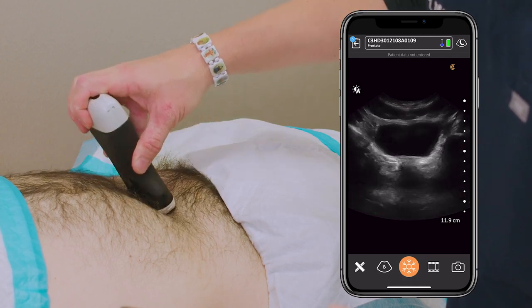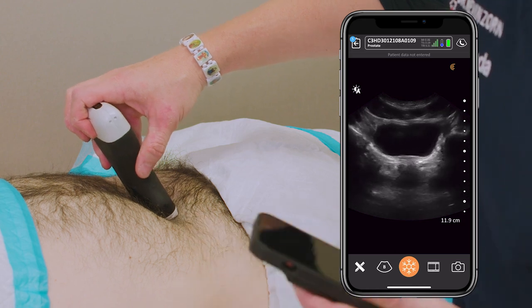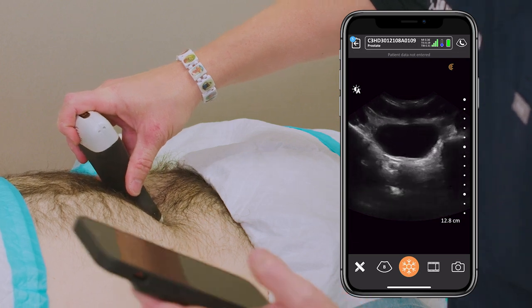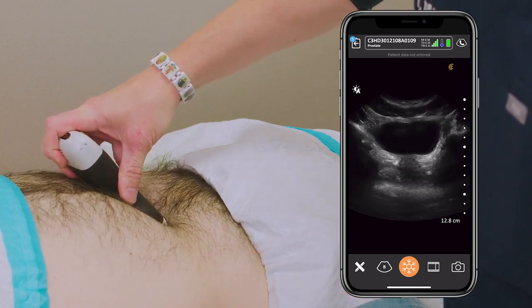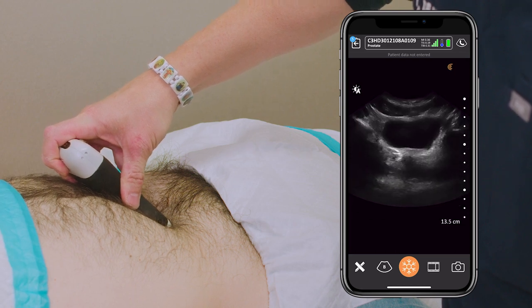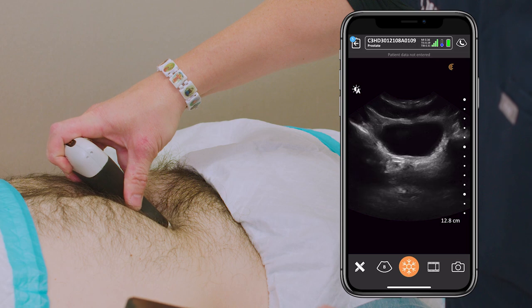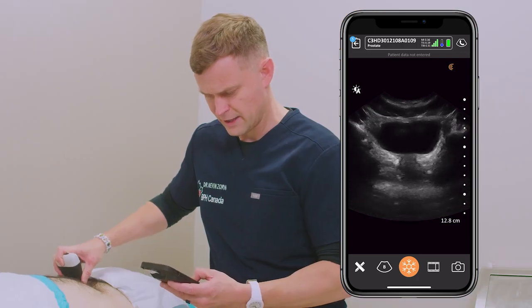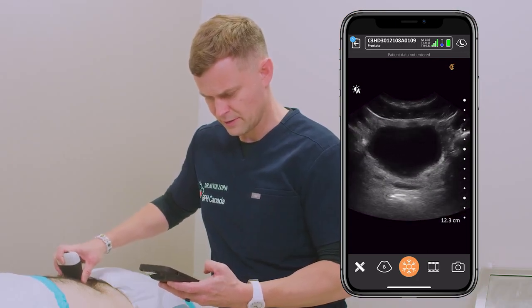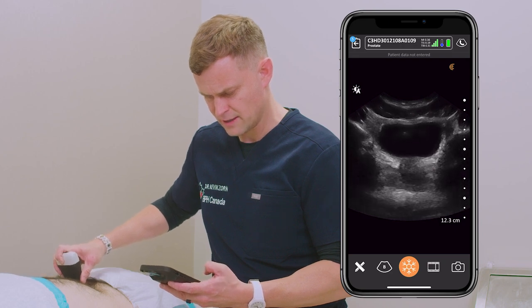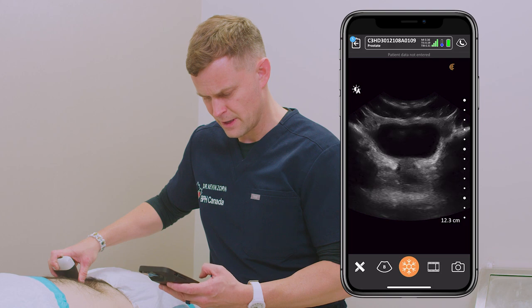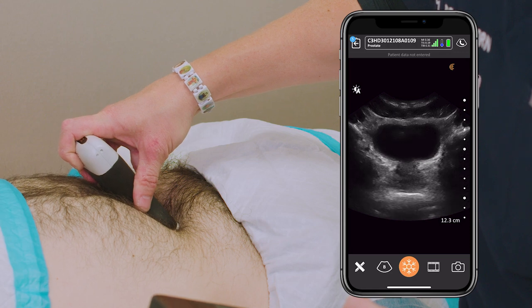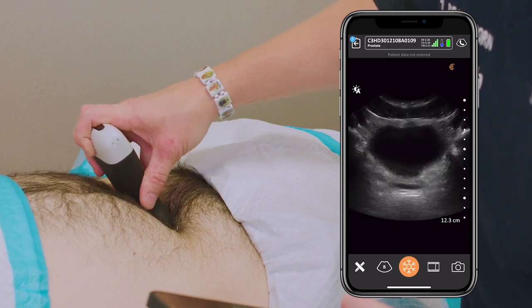This is where I'll depress down on the belly. For patients who are more obese we'll ask them to lift up their pannus so that it flattens the area. I usually want to push downward and cephalad toward the head and then get underneath the pubic bone to avoid the ultrasound being bounced off the pubic bone, which can get in the way for a view of the apex. Clearly a small prostate. I can fan it out and zoom in — there are the seminal vesicles, the little bunny ears behind the prostate. Those are normal, and as I fan downward there is our prostate. Just getting an idea of the echogenicity — is there any hypoechoic areas or calcifications suggestive of inflammation or chronic inflammation.